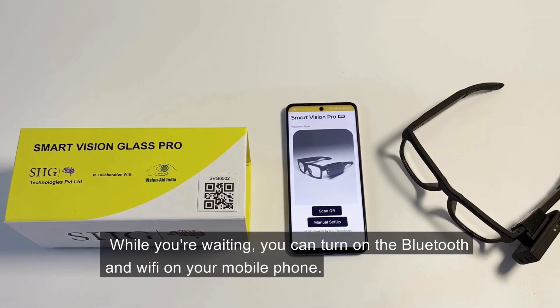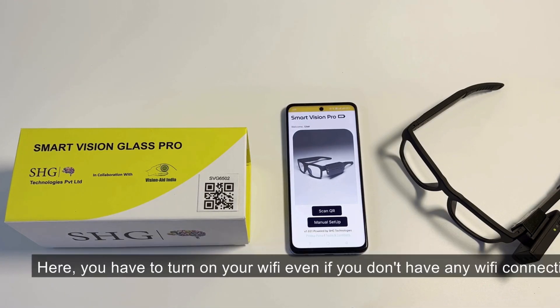While you are waiting, you can turn on the Bluetooth and Wi-Fi on your mobile phone. You have to turn on your Wi-Fi even if you don't have any Wi-Fi connection.